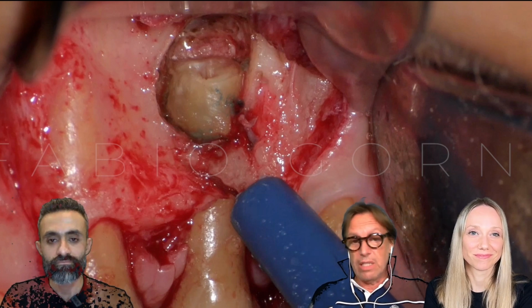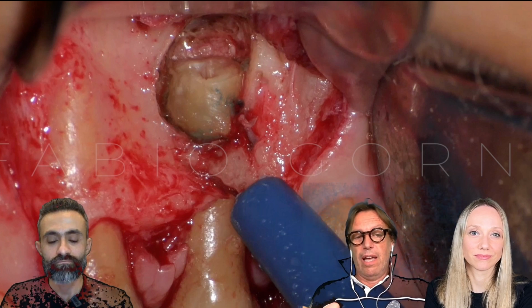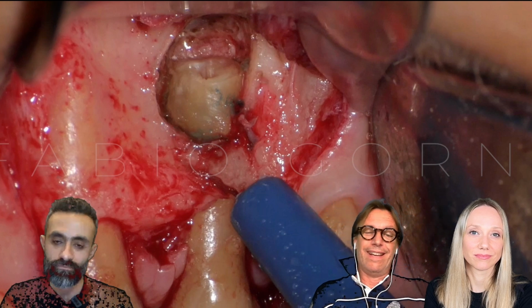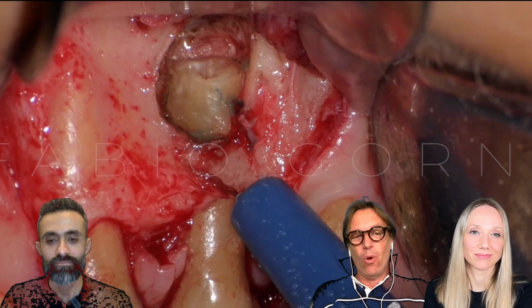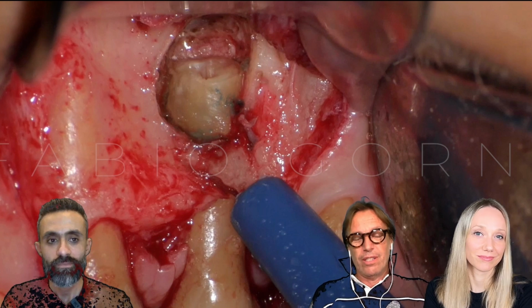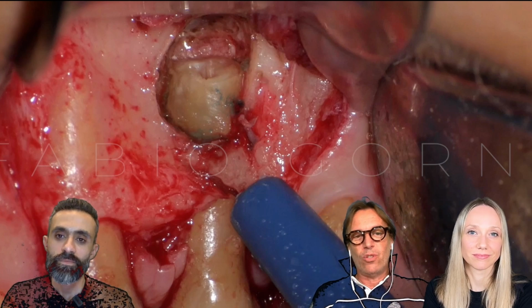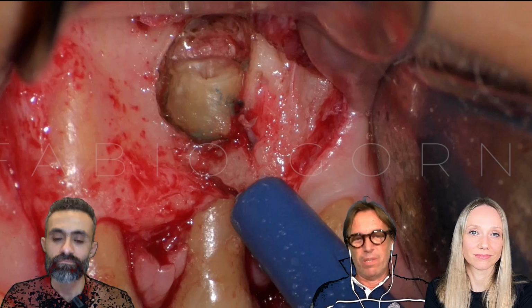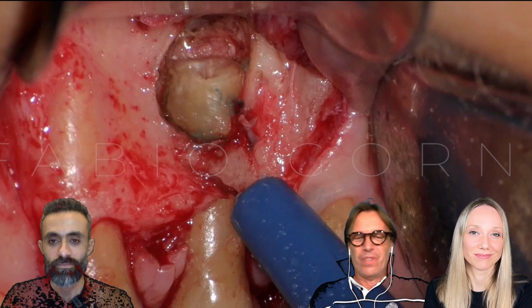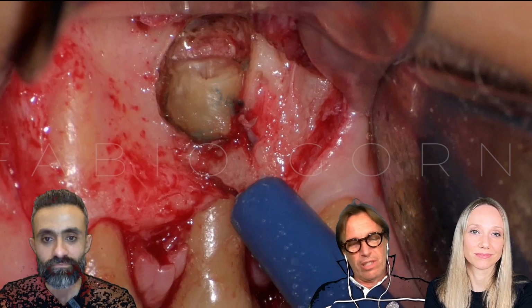Also, the reason to not do any bevel depends on the dentinal tubules that we open, but all the research published about this topic is in vitro. The difference between in vitro and in vivo is huge. Trying to reach the same results in vivo is different. Trust me, it's different. So is following our motto feasible, teachable, and repeatable all the time the same?